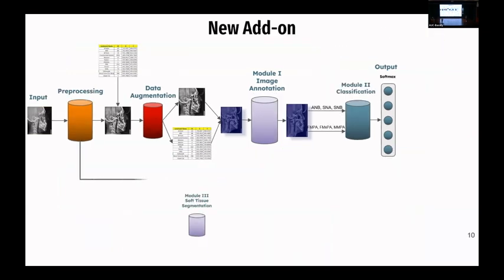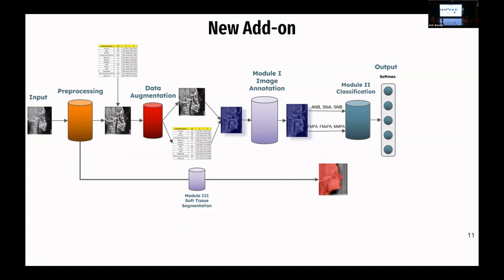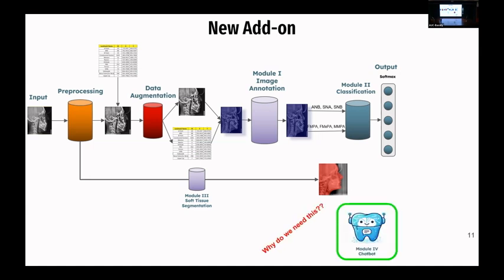We have a new add-on based on consulting Dr. Mustafa Dawalatli, and he told us that it's very important for the dentists to see the soft tissue segmentation. So we added this as an extra work on our thesis. And then we have added a chatbot as well. And this chatbot is going to help the dentists in the diagnosis for asking questions about the case. And all of this is going to be combined in our solution and the GUI OrthoNile.